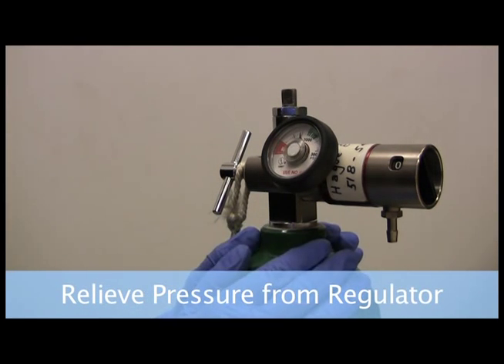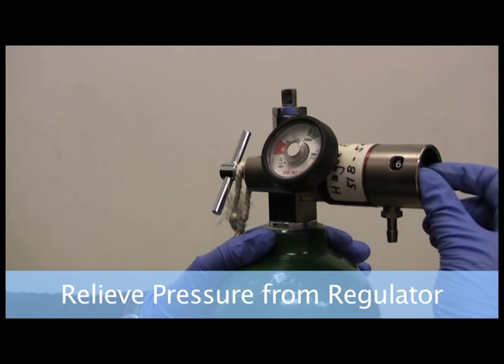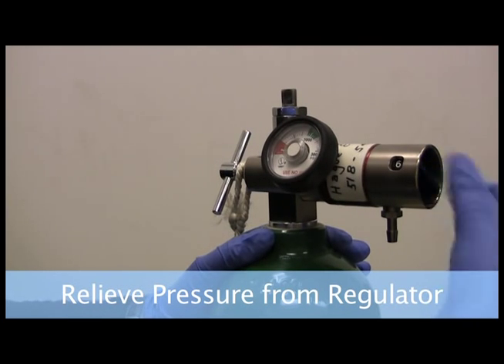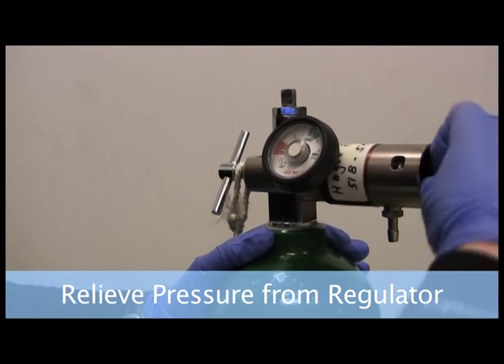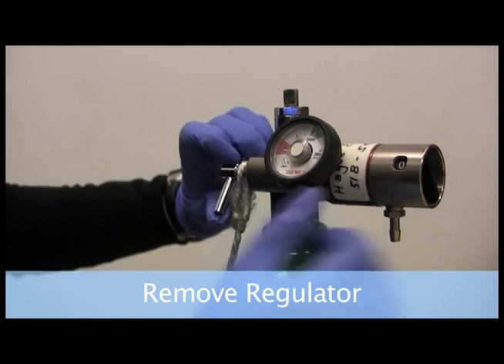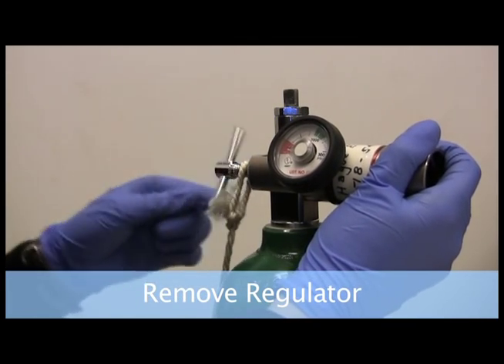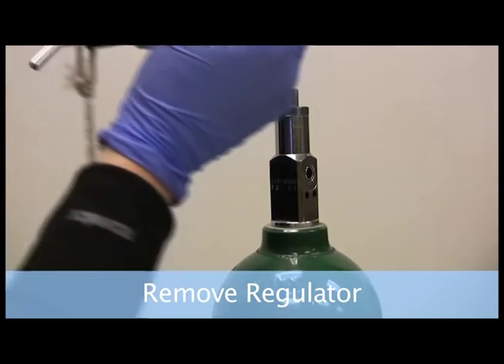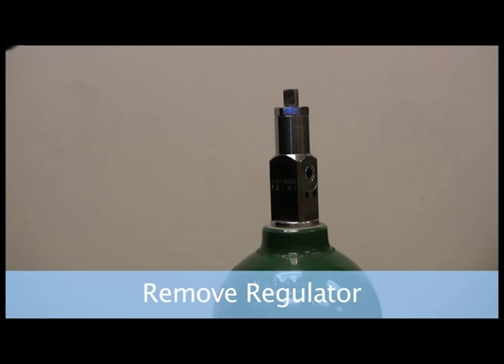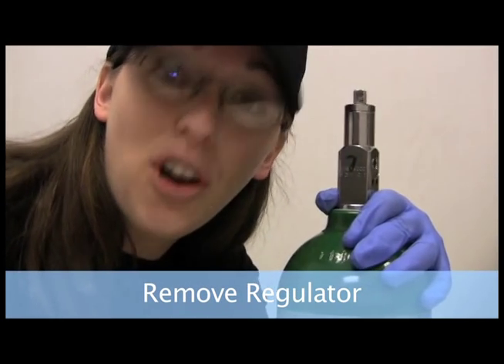So now that the tank is closed, we want to go ahead and bleed the tank so that we know all the air is out of the regulator and set, and we can go ahead and take off the regulator. And that is oxygen therapy.